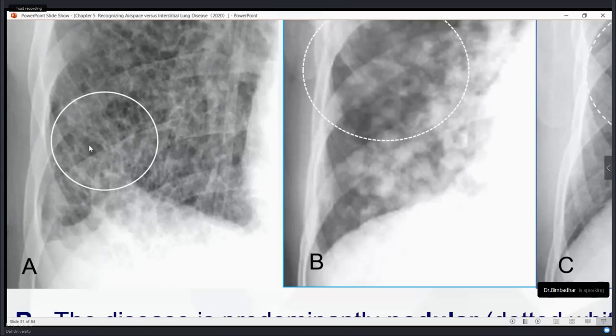Aman, is this doubt clear now? I can differentiate the pulmonary markings from the reticular pattern because I'm looking at the shadows of the bronchuses. The bronchuses usually accompany the pulmonary blood vessels, and the diameter of the pulmonary blood vessel is almost equal to the bronchus present with it.